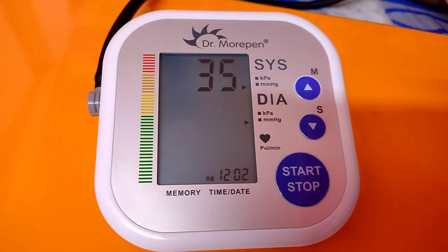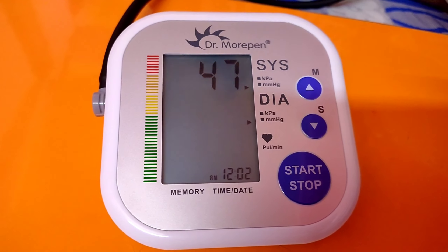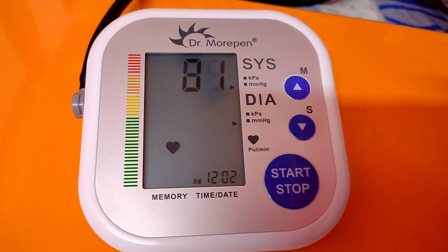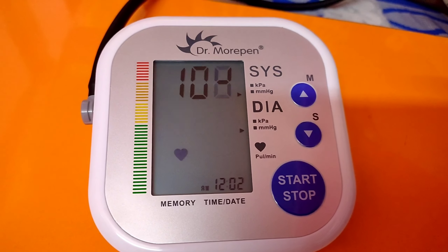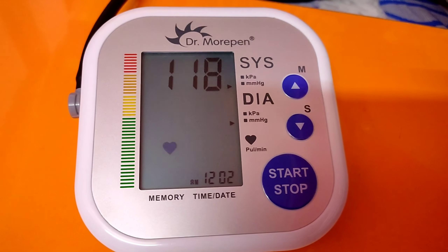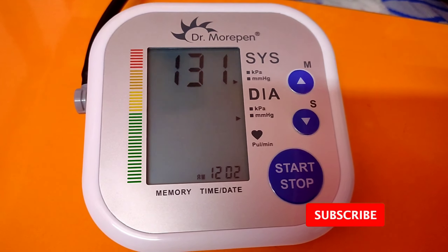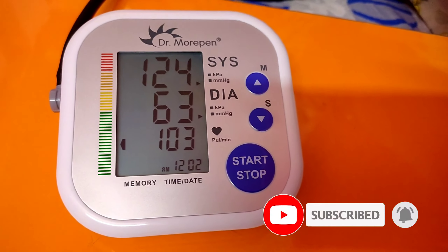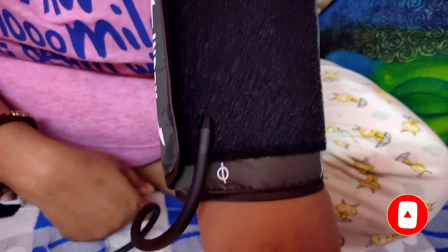Generally, this kind of blood pressure machine gives the result in seconds, so this is a very handy one to keep at home. I am measuring my own blood pressure in the machine for the very first time. Generally, I have a normal blood pressure tendency and this reading also shows a normal blood pressure. So I found this machine to be a good one for home use.